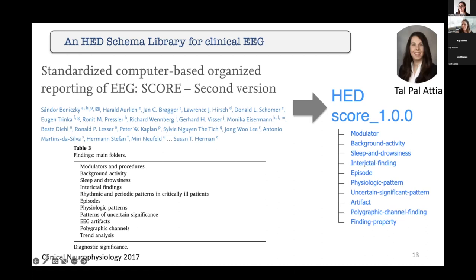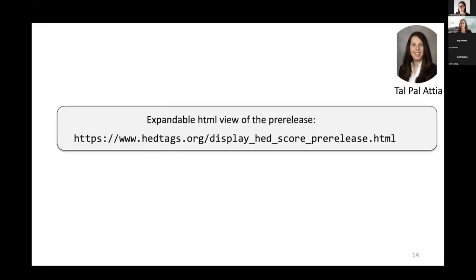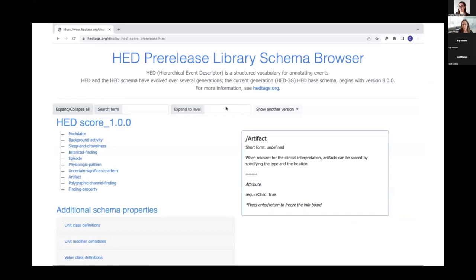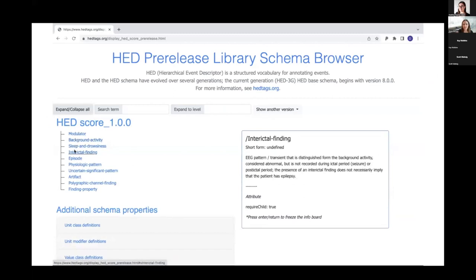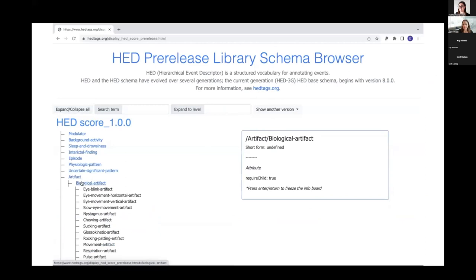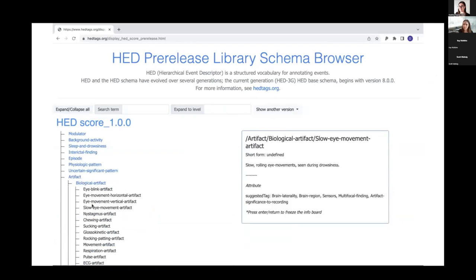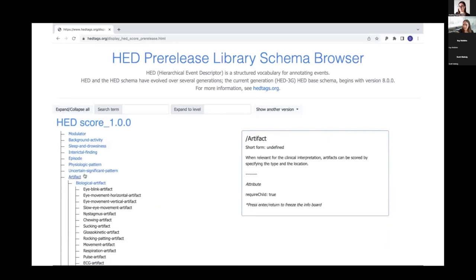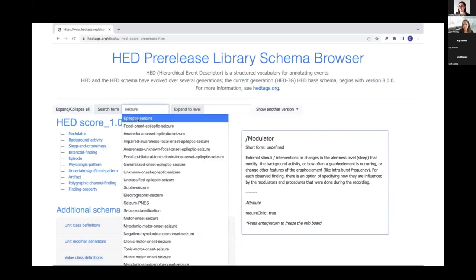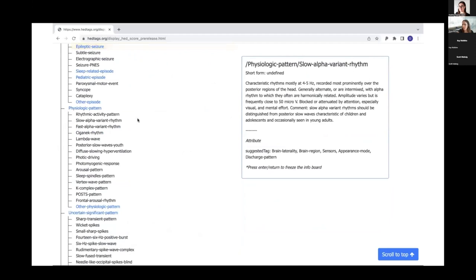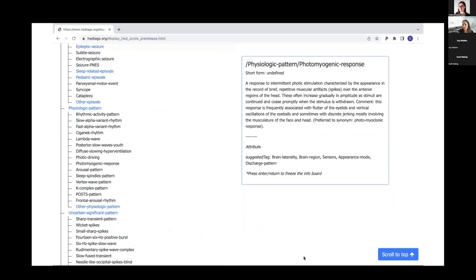This is a brief snapshot from the website showing how we translate such a table into the HTML view, where you can see the standardized terms we can use to tag our data. You can go to the website and browse the expandable HTML version in detail. You can see on the left the different types: for example, modulators, background, sleep, interictal findings. If you click on artifacts, you can find different types of artifacts and the standardized terms with the definition from SCORE — the original definition from the SCORE paper. You can also search for things like 'seizure' — epileptic seizures pops up at the top.